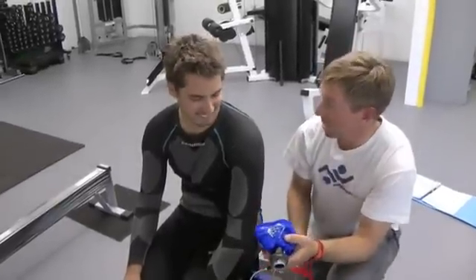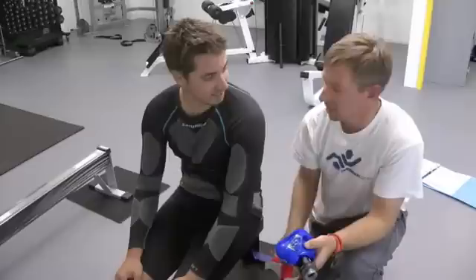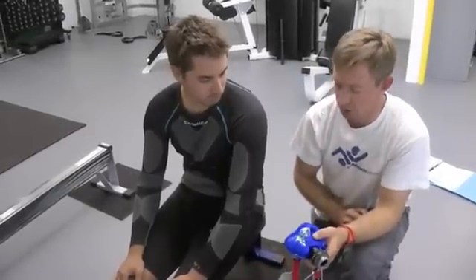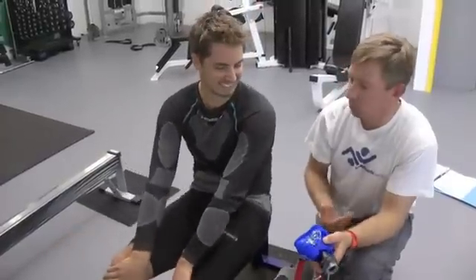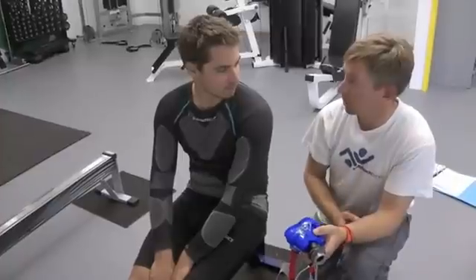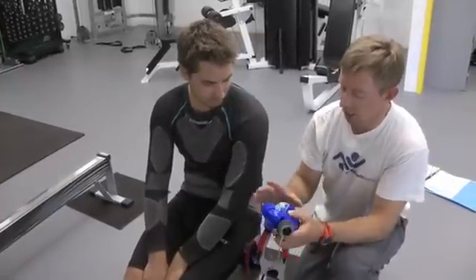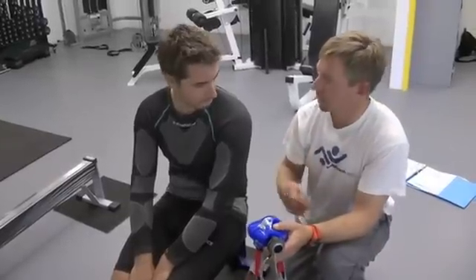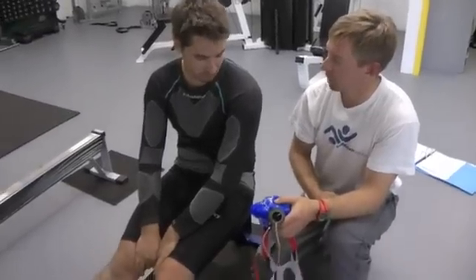So what we're going to do is a VO2 max test. This is a test of the maximum amount of oxygen that your body can use. We're going to use a rowing ergometer, so it's nice and specific to the rowing challenge that we're doing. It is a maximum test so it's going to be quite uncomfortable. You're going to row for up to about 10 minutes and towards the last minute you're going to be absolutely puffed out. We're going to put a mask on you and then get you to incrementally increase your speed and stroke rate on the machine until you get to the point where you can't keep going any further. Happy with it?